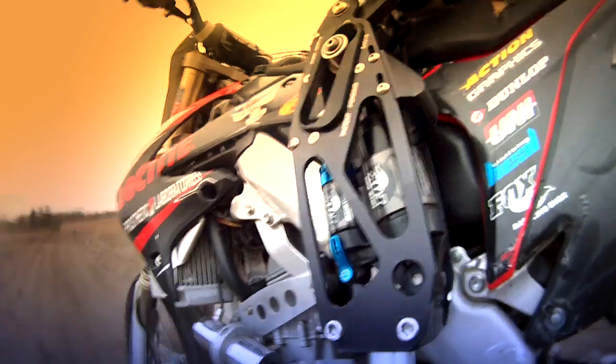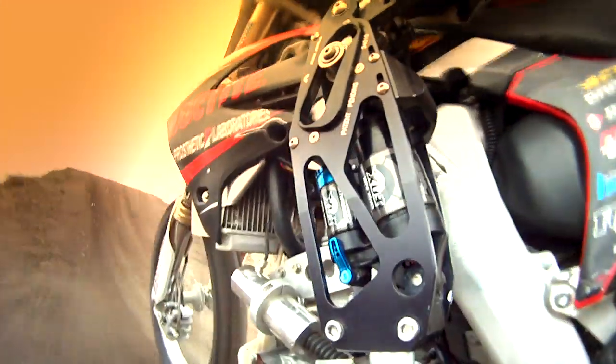It works great and the Fox shock is the key component that allows it to do that. The big advantage compared to anything else is that it gives me spring return. Now I've got all kinds of prosthetic components with Fox shocks in them.